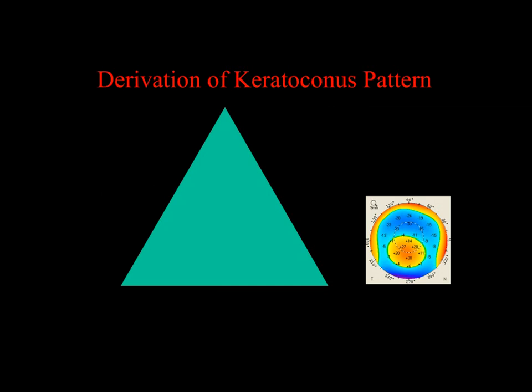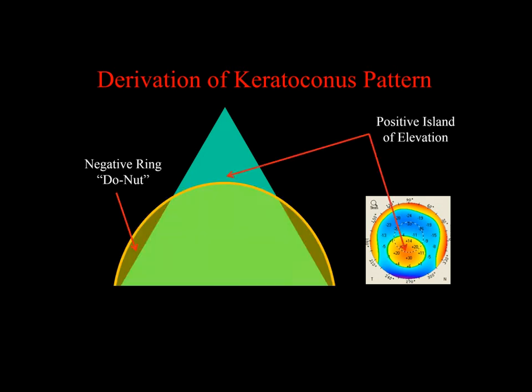Well, if we just take, again, use an analogy and exaggerate, just take a cone, a pure cone. And if I was to say, okay, how would that cone look against a best fit sphere to that cone? This is what would happen. Notice that the top of the cone is truncated, corresponds exactly to what you see, and the tip of the cone is the highest point.